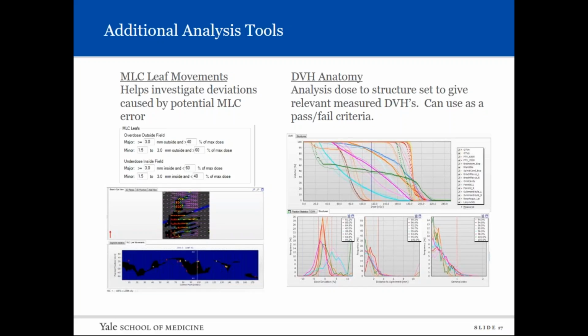And this is just a really helpful tool to see why a diode might be failing and to go back, look at your MLCs, see if it actually is because of that. And we've had pretty good results with this, actually corresponding to what Delta4 tells us might be wrong and showing that that is actually what is wrong with our MLCs at that point.